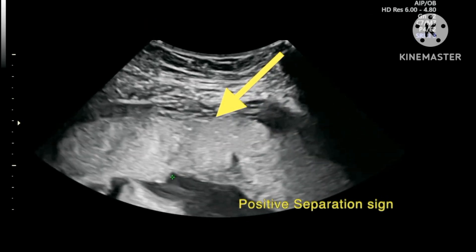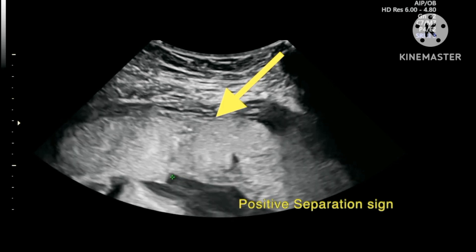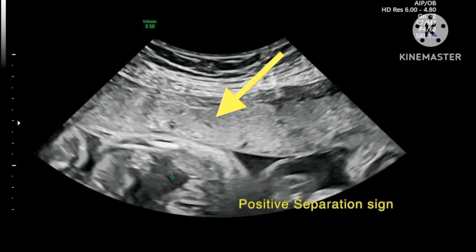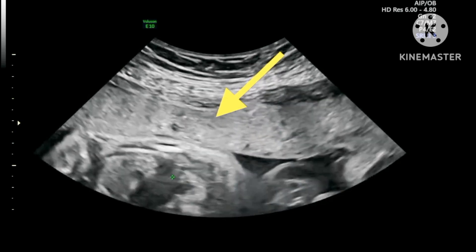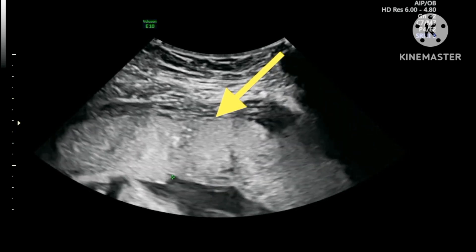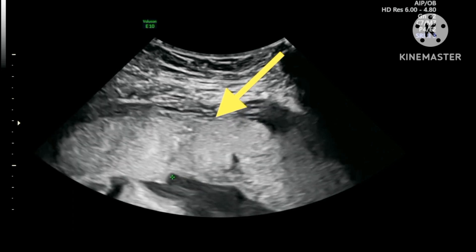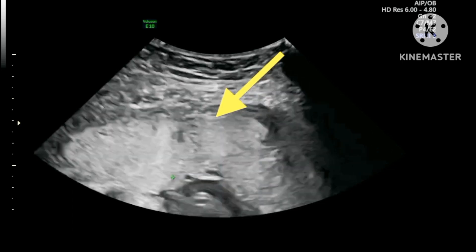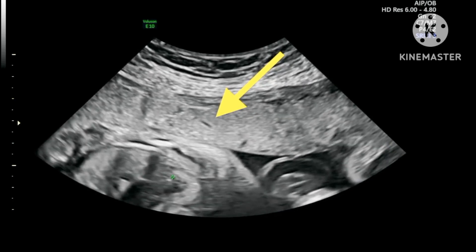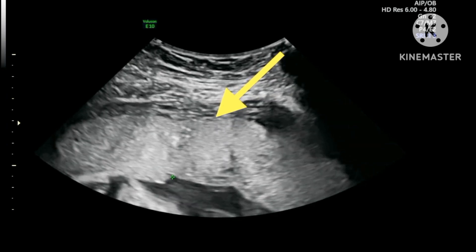This is an example of a positive separation sign. This sign is a reflection of the difference in elasticity between the muscular myometrium and the placenta. After the placenta is compressed against the myometrium, when the pressure is released, for a brief moment the placenta appears to continue moving after the myometrium has become stationary. You can see this at the tip of the yellow arrow — the placenta appears to keep moving, and the clear zone is briefly enhanced.